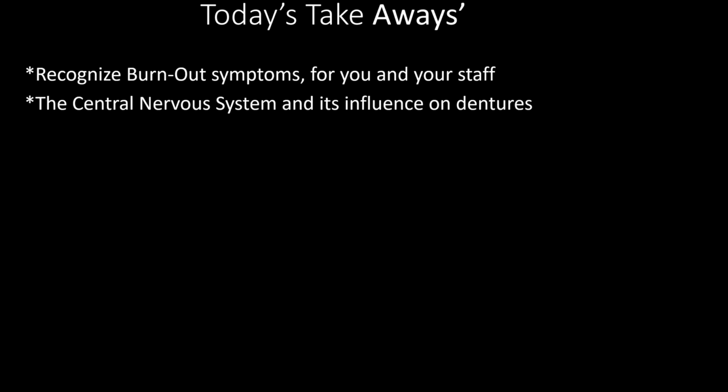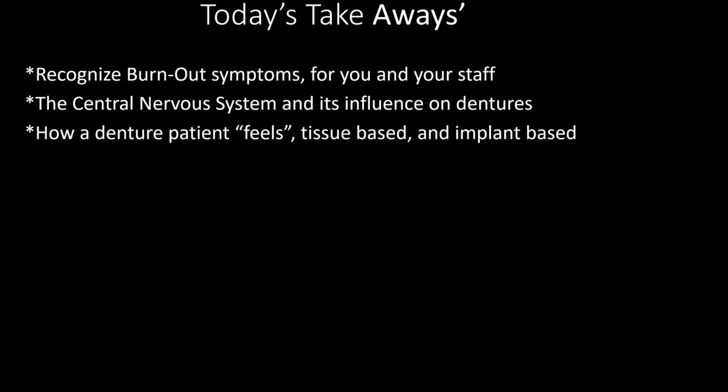And that story is it's not working. So now what are we going to change? Do we need to back off the vertical? Do we need to have the teeth function so that they're functioning out to the left, because that's where the patient functions? That's what I want you to stop and do, is the soft side of this.